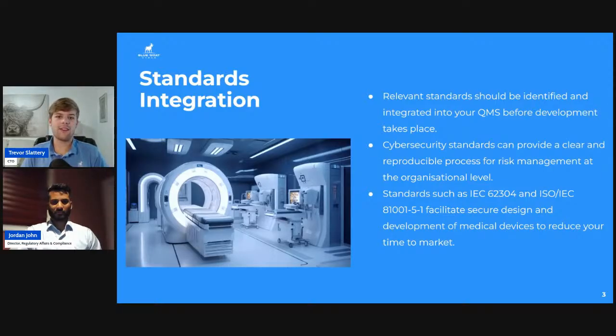We also want to look at standards that facilitate secure design and development process of medical devices that is going to reduce the time to market. I know Jordan can definitely speak to this point since he's seen a lot of the ins and outs of the submission process with a lot of our clients, but not having a clear process can definitely really cut down on that streamlined flow getting into the FDA submission and massively increases the time to market. So I'm interested to hear your thoughts, Jordan, on what are some of the main points that we need to look at for that early integration of a reproducible standard into our development practice.